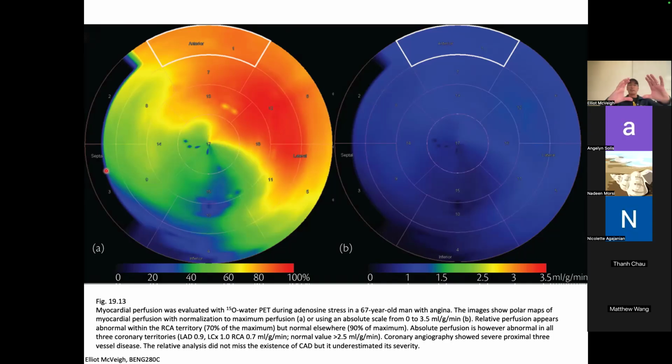So it's like a bullet that we're looking at the tip of the bullet, and we can still see the edges off to the side, right? These are higher, they're back away from us. And so we go from the tip or apex of the heart down to the base, and then this is the anterior wall. Remember, the patient's chest is up here. The posterior wall of the heart, the patient's spine would be down here. This is the septum. RV is over here, right? The right ventricle is over here.